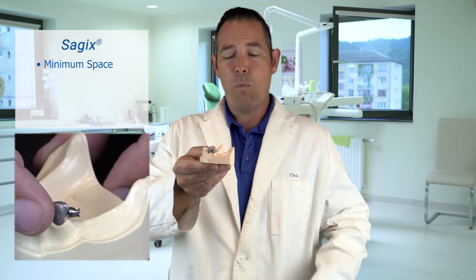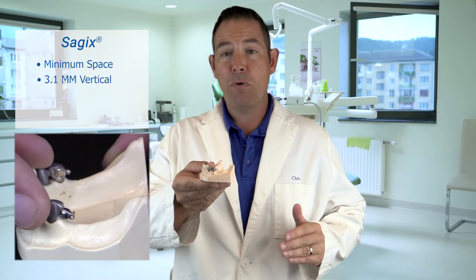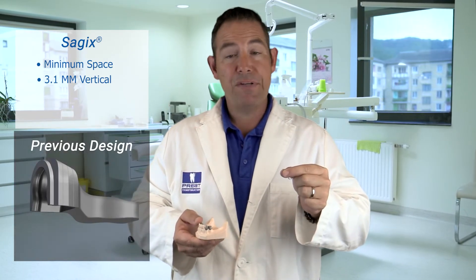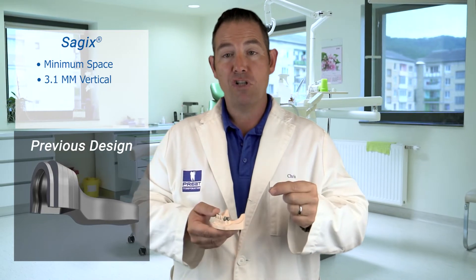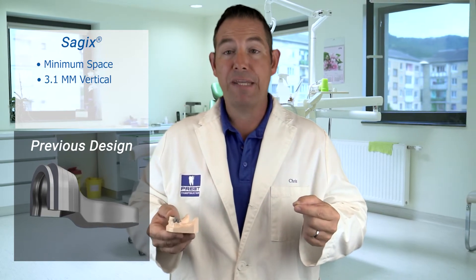The other part is that it's minimum space. As you can see here, the 1.7 millimeter Sagix, including the prefabricated housing, only requires 3.1 millimeters of vertical. We recently redesigned this housing because we listened to you. Our previous housing was big — much longer, much taller. And the other housings on the market are also huge, that's if you can even find a prefab where you don't have to cast it.